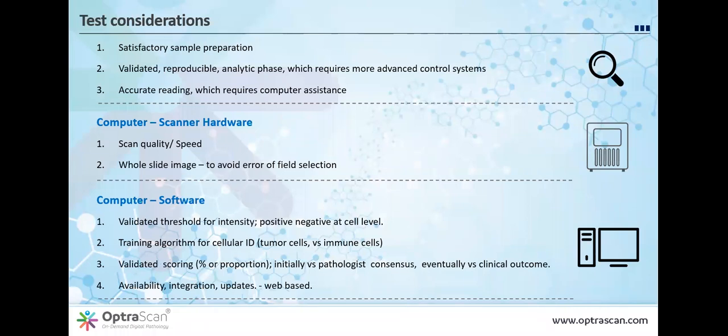It turns out that about half of the labs in Europe and many in the US, although the number in the US is not as clearly known, in fact, are not adhering tightly to an approved assay, or are not using an approved assay at all, but are using an in-house lab-developed test. If you're going to do that, then you have to validate that in-house test against an existing approved test. And then once you've done that, adhere to your new protocol.